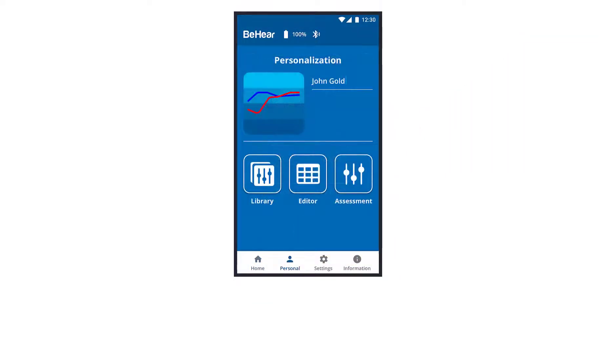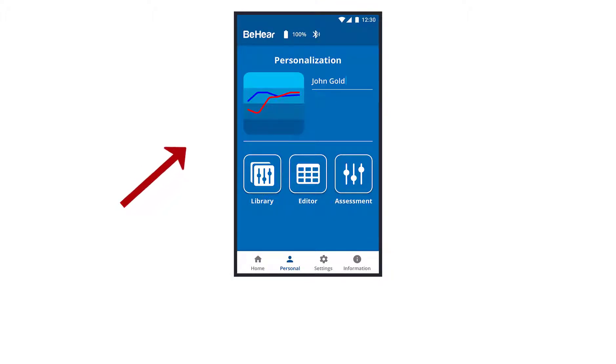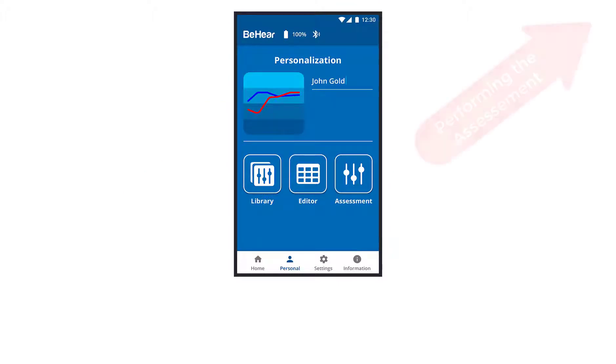The app's personal section displays your latest hearing assessment results if you've performed the built-in hearing assessment. If you haven't yet performed the assessment, watch this video for instructions.